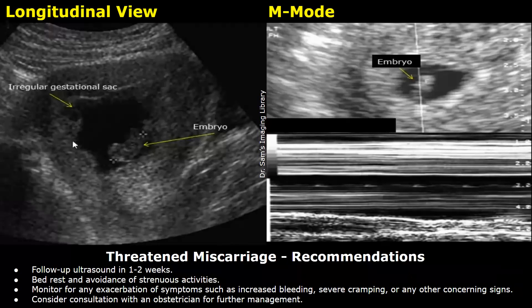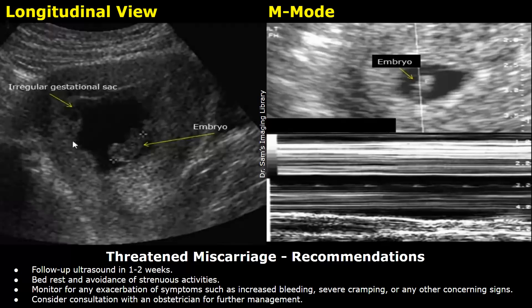Here are the recommendations: follow-up ultrasound in one to two weeks; bed rest and avoidance of strenuous activities; monitor for any exacerbation of symptoms such as increased bleeding, severe cramping, or any other concerning signs; consider consultation with an obstetrician for further management.